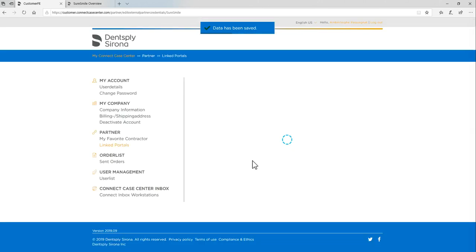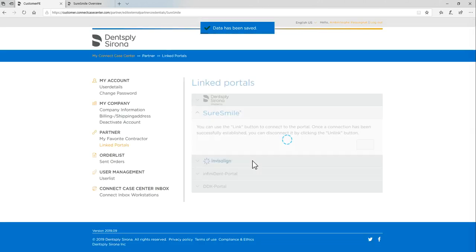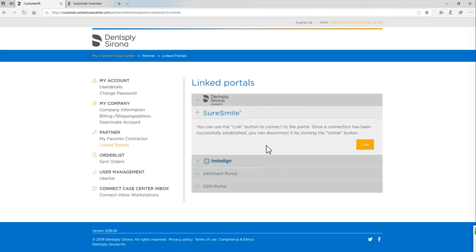This will automatically prompt you to link your SureSmile account under linked portals. Both of these steps will need to be completed in order to successfully submit your SureSmile cases using the Sirona Connect portal. And that's how you link your SureSmile account.